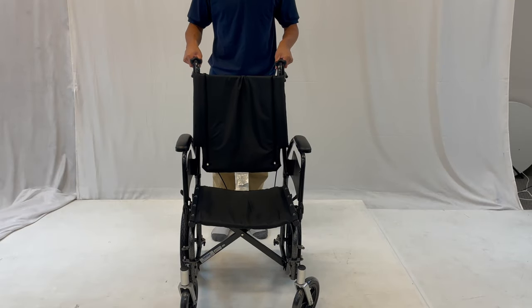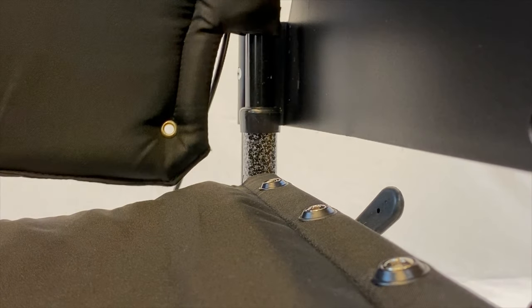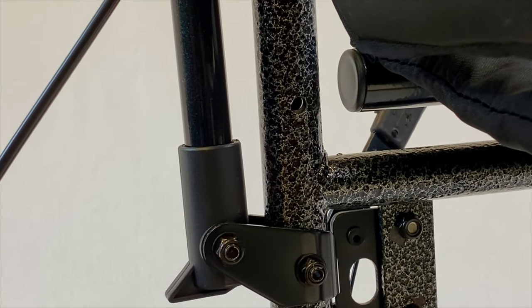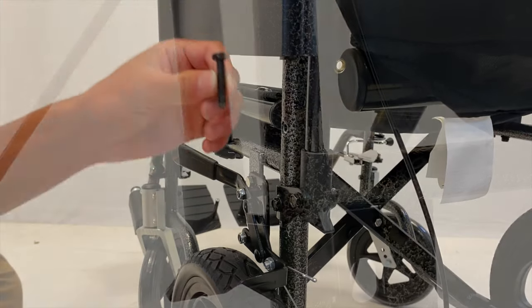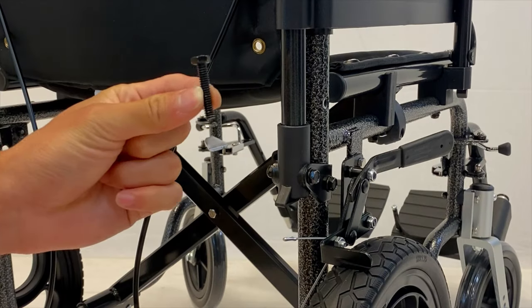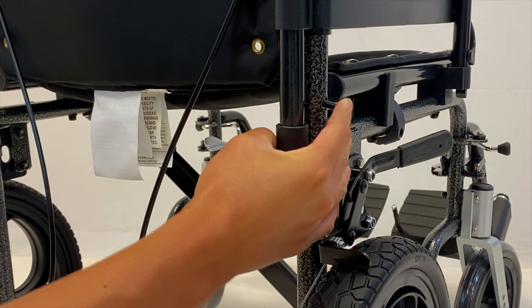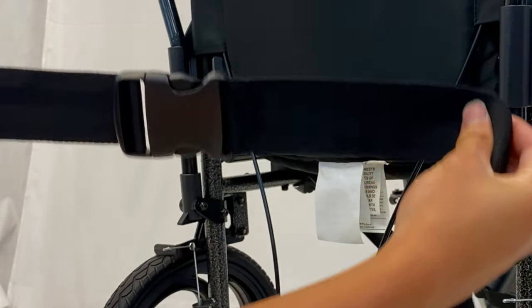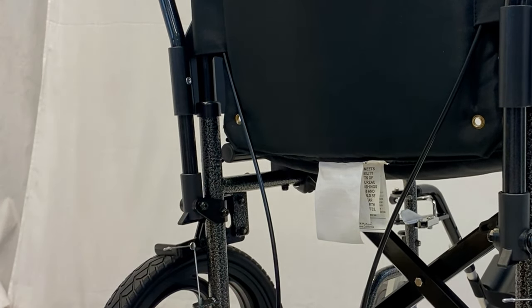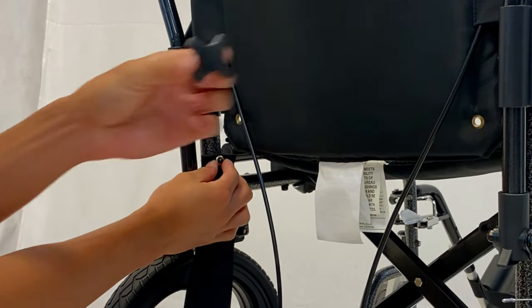Insert the handlebars of the backrest and make sure the holes are aligned. Insert the bolts into each aligned hole. The optional seat belt is applicable in this process, where you place the golden rings onto the bolt end. Then secure it with the knob.